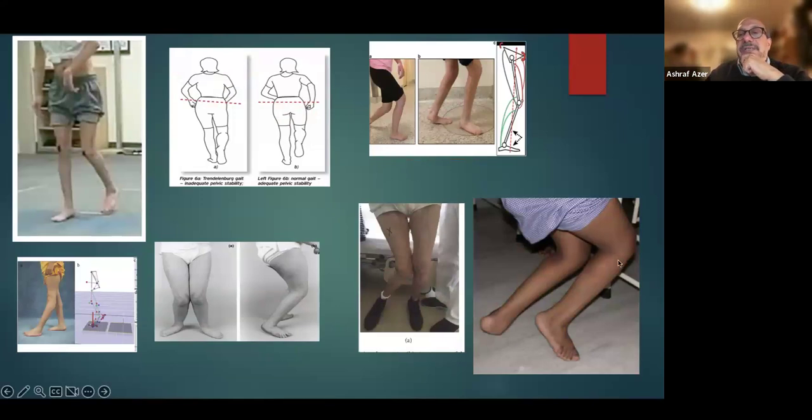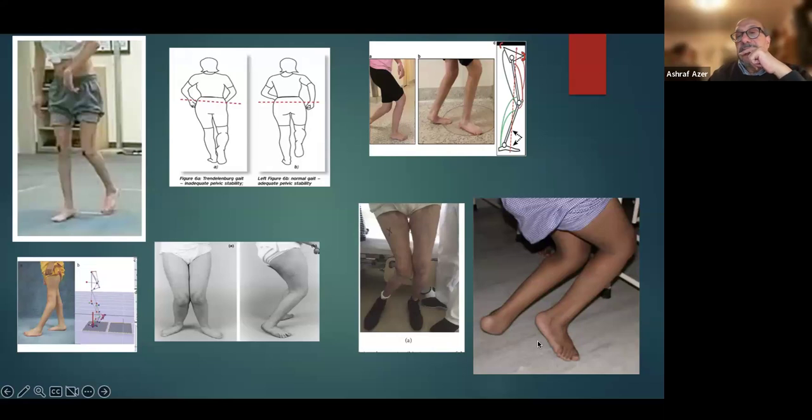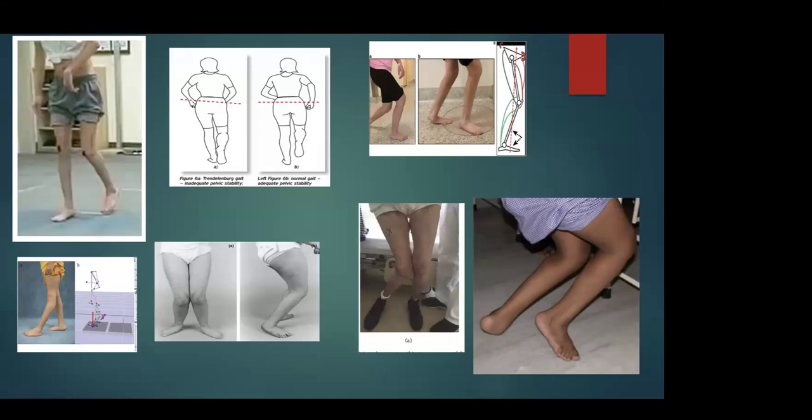Let's say this one. This is very common, you have seen it all the time. The crouch gait. Spastic gait? Why? Do you need an orthotic here? No, spasticity is the issue. It's mainly due to spasticity, so orthotics might not help it.